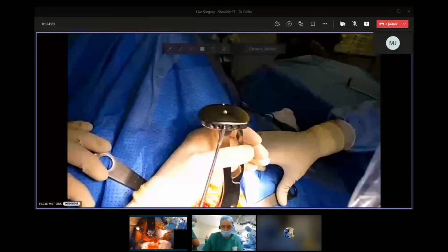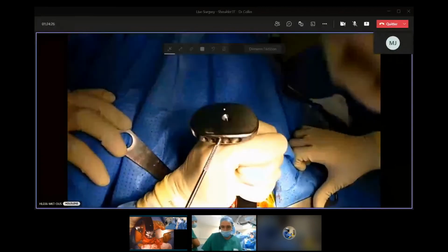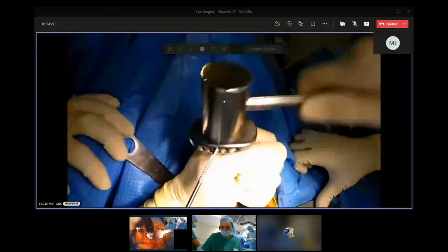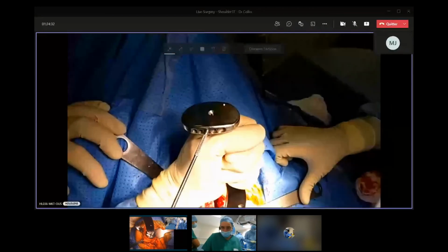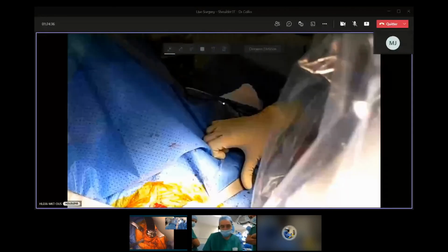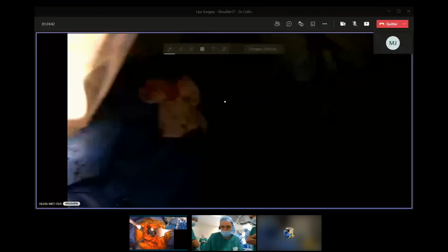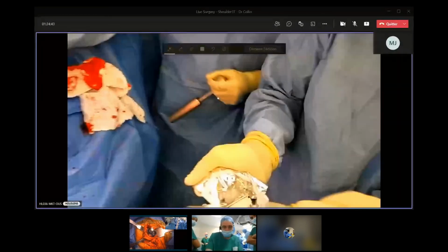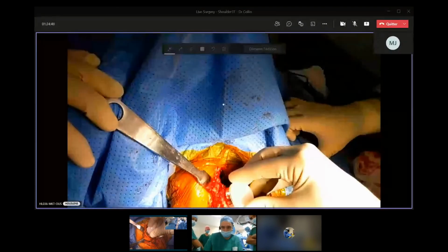Maillet, s'il vous plaît. Merci. And done. I fixed it. I call that the twist test. You see, you have a very good primary fixation. That's good. Now we're going to put the tray, the pulley, sorry. This is the tray. 36 plus 6. Plus 6 means the minimal one.